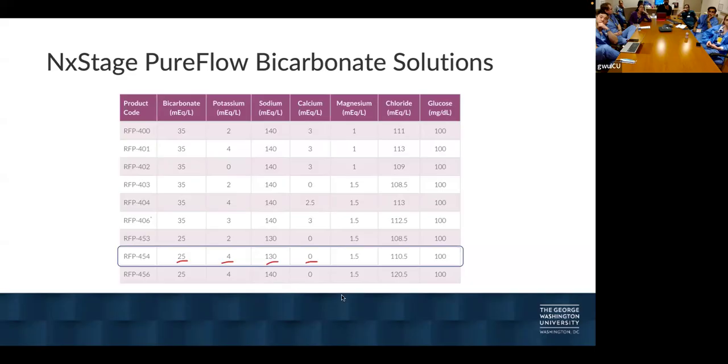So the potassium is 4, but all of the citrate fluid has fixed potassium. There's no different bag; there's only one bag. It's 0 calcium, 4 potassium. You wouldn't mix bags, because there wouldn't be enough citrate. If you mix bags, one of those bags has calcium, so you would require more citrate. Bear in mind, most of those patients who are having big-time problems, you're probably better starting with non-citrate and then switching to citrate in 24 hours, and 4K should do just fine.